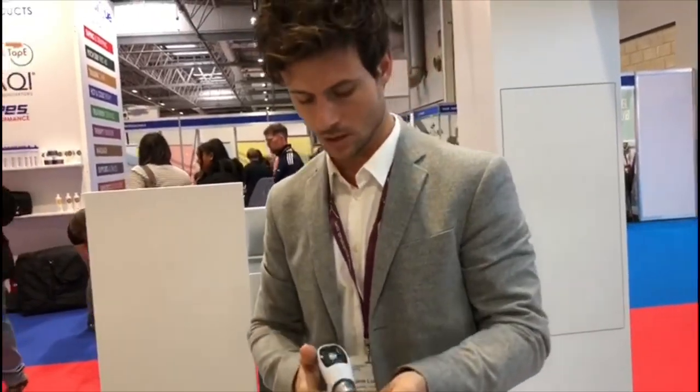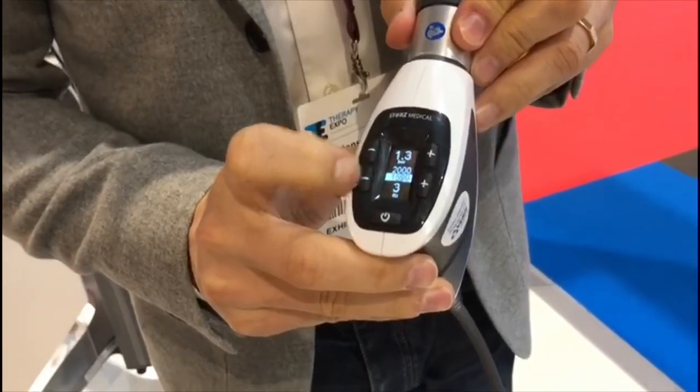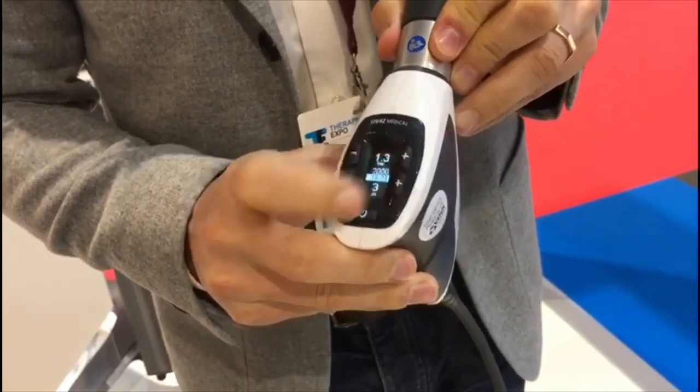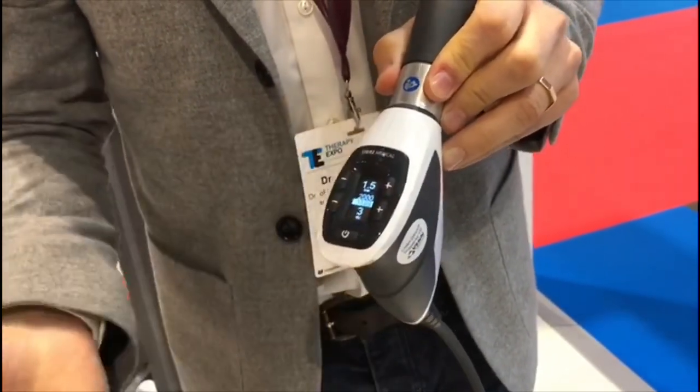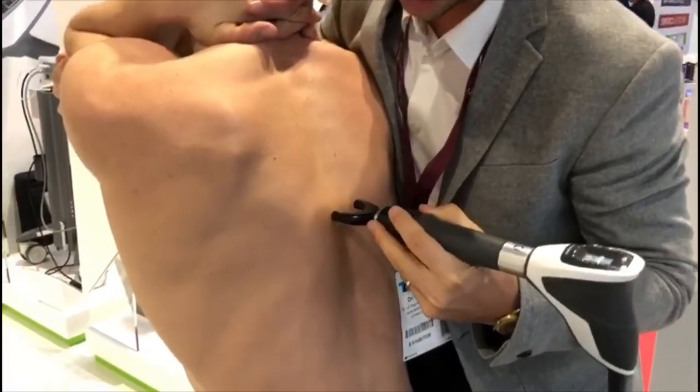When trying to mobilize the joint, I will use low frequency because I don't want a reflex response from the body. So I will use low frequency, maximum 3 Hertz. I might go down to 1 or 2 as well, but 3 I would say. Bar-wise, you can start at 1.5. That's okay. Like that. The region, just like that.